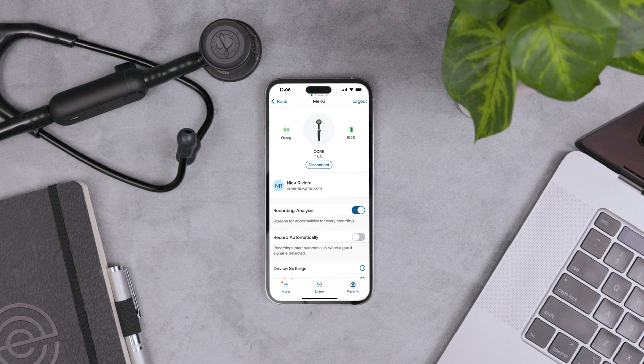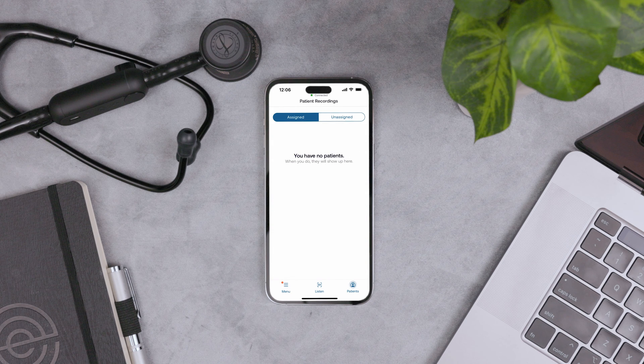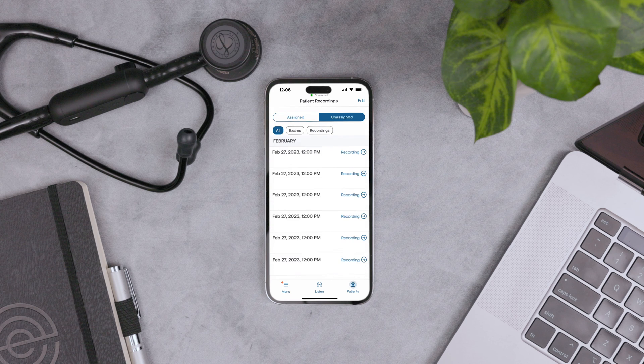On the Menu screen, change your app, account, and device settings. Recording Analysis uses AI to check for signs of heart disease for every recording — this is on by default. Record Automatically means the recording starts automatically when the Core detects a good signal. You can navigate between assigned and unassigned recordings.